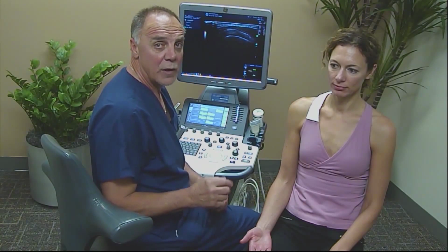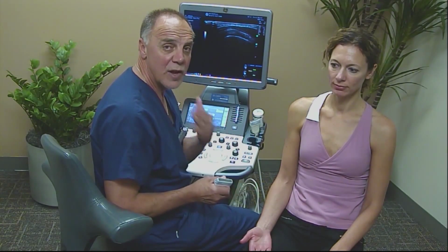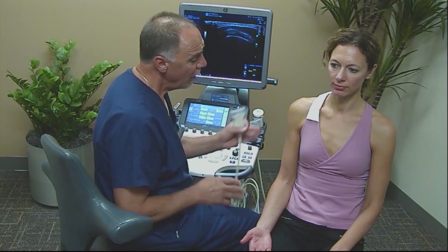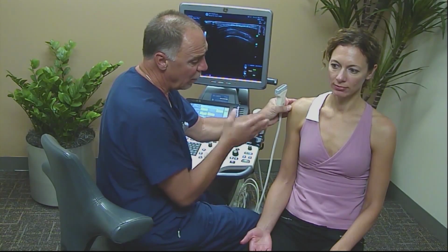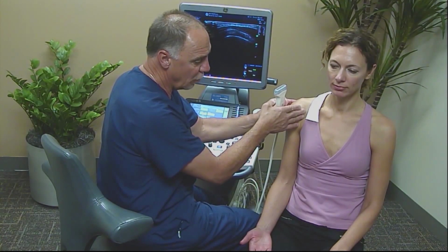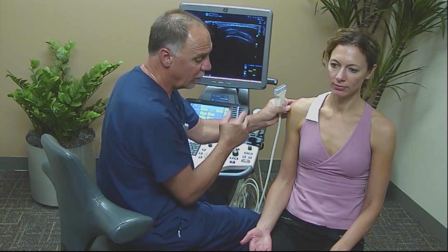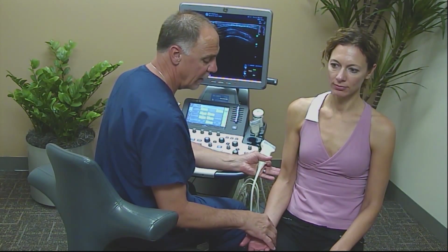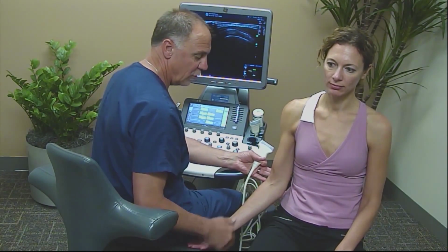Now that we've evaluated the long head of the biceps tendon in long and short axis, we'll move on to our next anatomic structure, which is going to be the subscapularis. Now, in order to look at the subscapularis, primarily when the hand's in the neutral position, the subscapularis lies underneath the coracoid. In order to bring the subscapularis out for evaluation, we ask the patient to keep their elbow up against their side and then just do an external rotation and let their arm sit in external rotation.